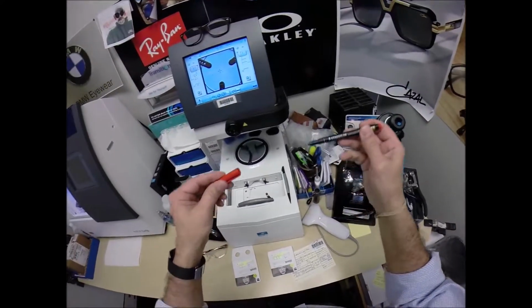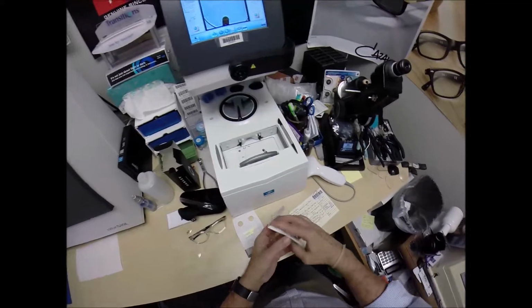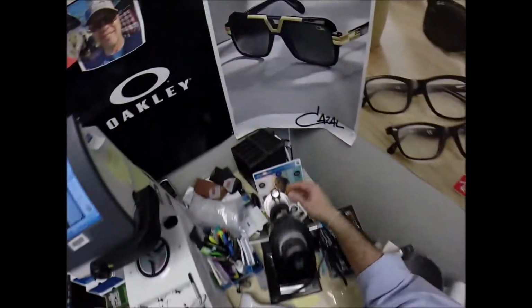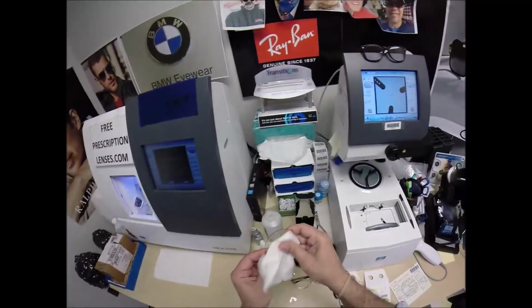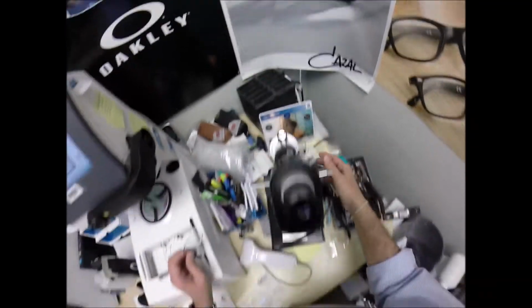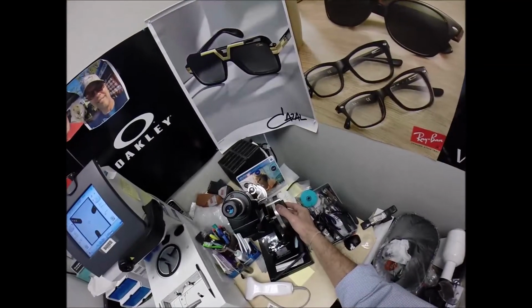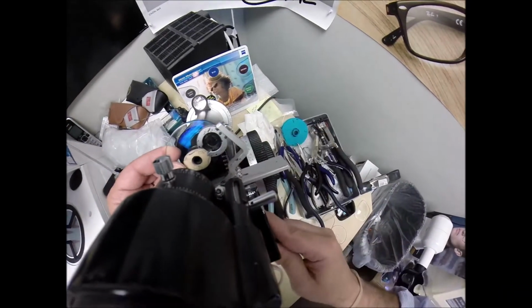Now if you guys missed any of that, let me recap. Oh, you know I had to say that. Alright, let's take the left lens out. Spin the axis wheel to 180. Oh, you know what? I was never on 2. Look at me. Shame on me. Let's spin the axis wheel to 2. Now we can put it on -1/4. I'm glad I caught that.